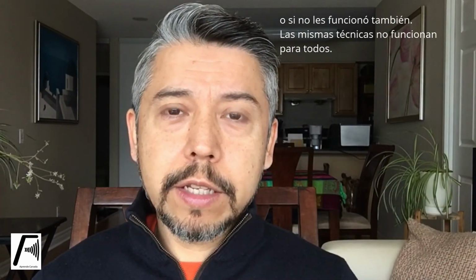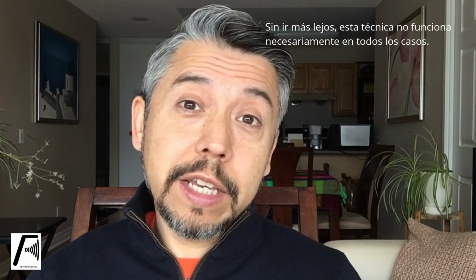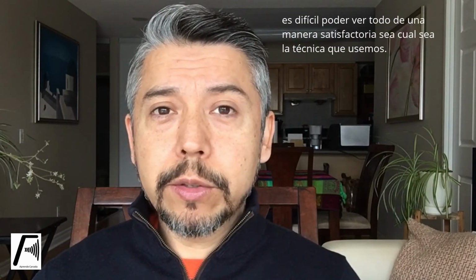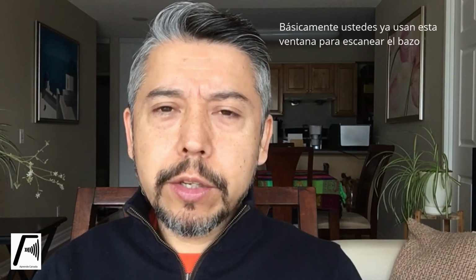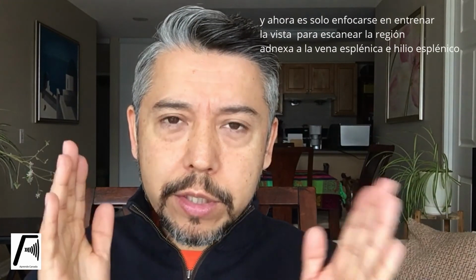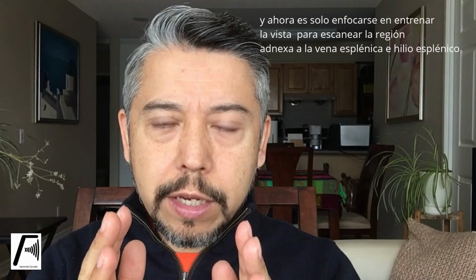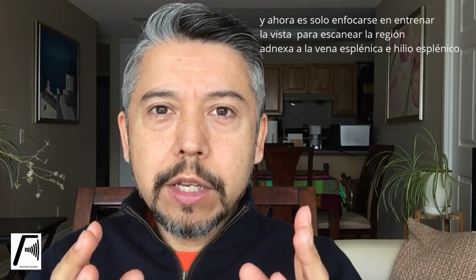You know, it's not for everyone, of course, and actually it doesn't work for all the cases. As you know, sometimes you see the tail beautifully from the anterior window, or if the patient is a difficult one, then no matter what we do, it will be difficult. But again, it's just another window to have in mind. You already used the window, like I said, for the spleen, but it's just a matter of now training your eyes to look at that area adjacent to the splenic vein and the hilum, so that you can look for that pancreatic tail.